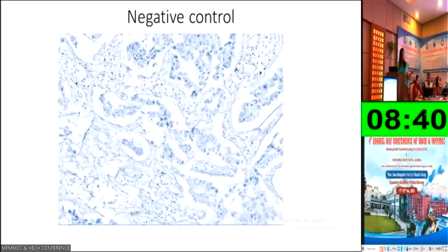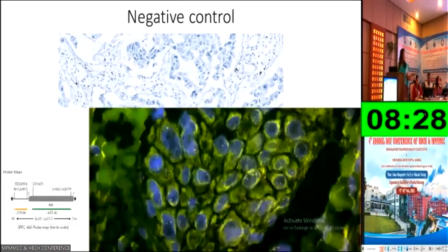You first see the negative control. It should be dead negative. And second is clinical finding. If this is a scenario, a young patient, female, non-smoker, give it the benefit of doubt, say it is equivocal and ask for a reflex testing by FISH or NGS.